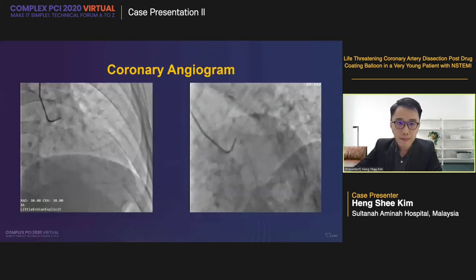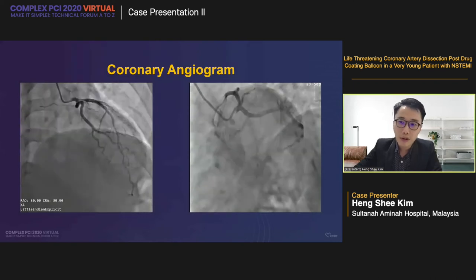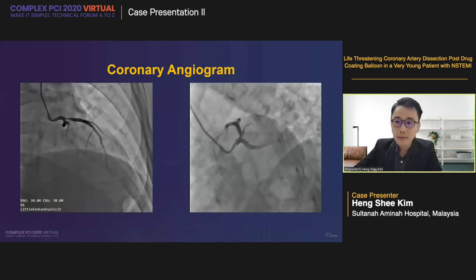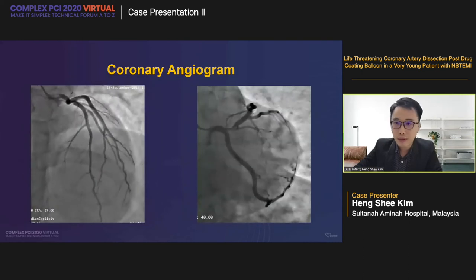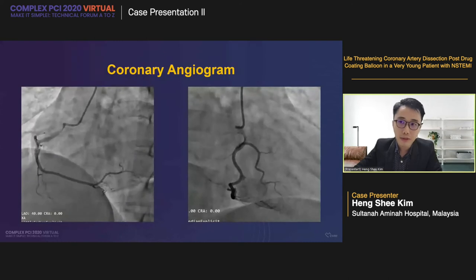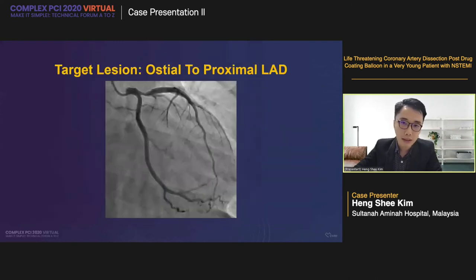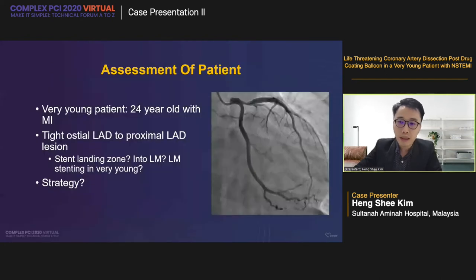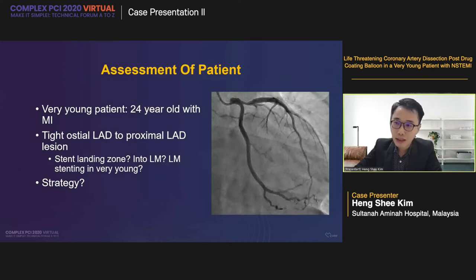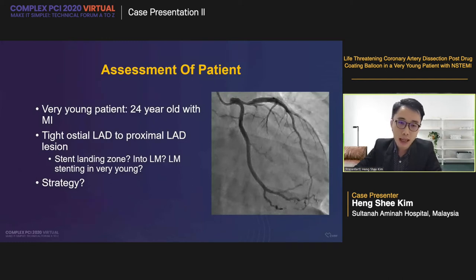He was planned for inpatient coronary angiogram. Angiography in AP cranial and spider views showed a tight ostio-LAD stenosis. The circumflex was normal and RCA was rather normal too. Our target lesion was an ostio-to-proximal-LAD stenosis — approximately 80% — causing his non-STEMI. Considering this very young 24-year-old man with MI due to tight ostio-LAD to proximal-LAD lesion, we considered key issues: he definitely needs revascularization, but what is the best strategy? We considered stent landing zone — should we land into the left main? And is there any concern with left main stenting in such a young patient due to stent thrombosis and in-stent restenosis risk?